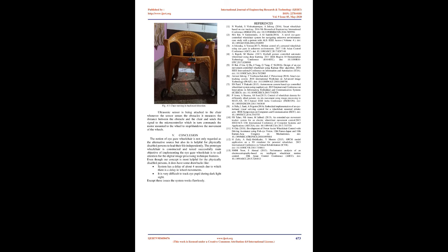Figure 4 shows the different positions of chair based on eye movement. To check the proper working of the model, first the chair is placed in fixed position. Once the webcam captures the eye image, and image processing is being done, based on the resultant of the image processing technique, the motor mounted to the wheels does not show any movement and there is no change in position of the chair. Fig. 4.1. Chair in fixed position.